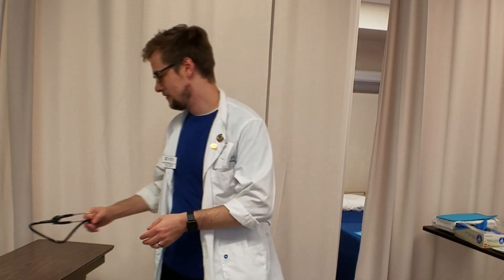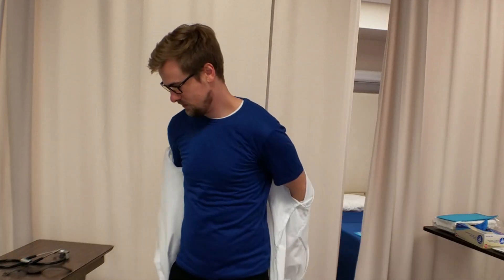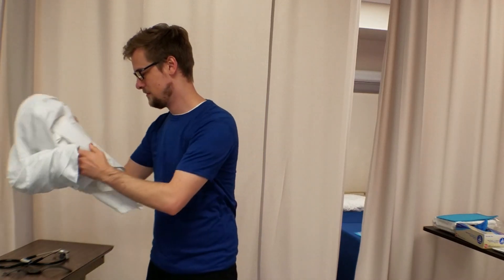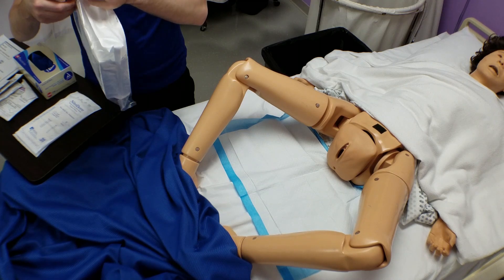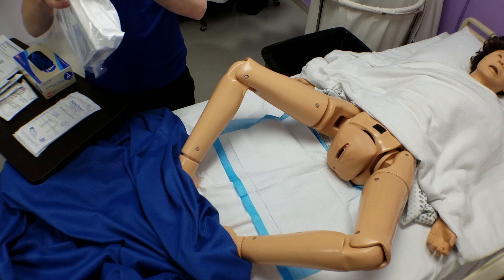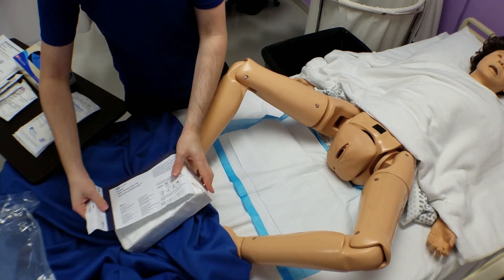Before beginning the parts of the procedure requiring sterile technique, it is important to remove clothing or objects that could encourage contamination. Remove hanging objects, garments with loose long sleeves, and watches. Be advised that large rings can tear gloves. Now open the outside plastic packaging of your Foley kit. Place the kit either on your bedside table or at the foot of your patient's bed before opening. In the field, you can consider using your bag as a waste container at the foot of the bed.